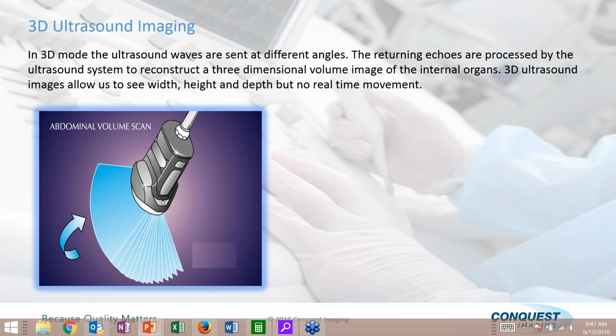3D imaging. 3D imaging has been out for quite a while. The technology has gotten absolutely amazing. As I mentioned earlier, my wife is a sonographer. Her specialty is high-risk obstetrics, and so she specializes in doing multiples. And so she does twins and quints and quads and all that, and she sends me these three-dimensional images all the time that are absolutely amazing.